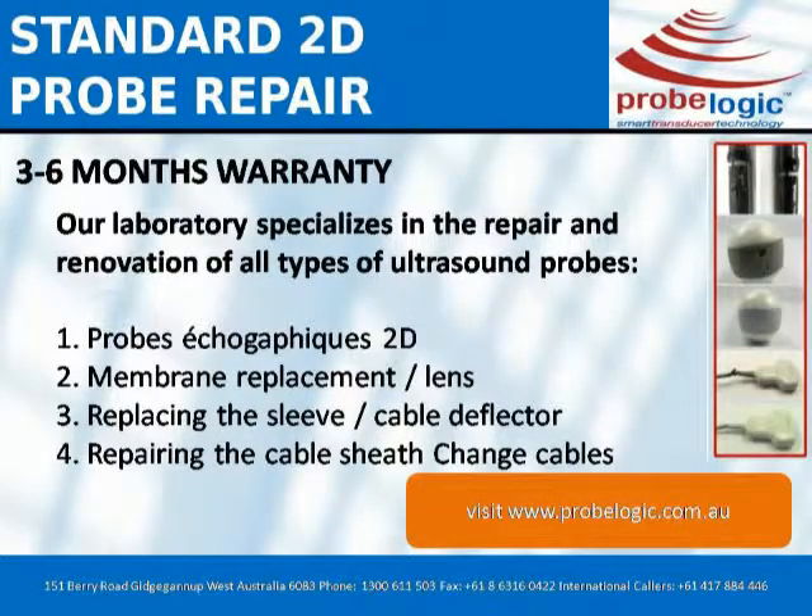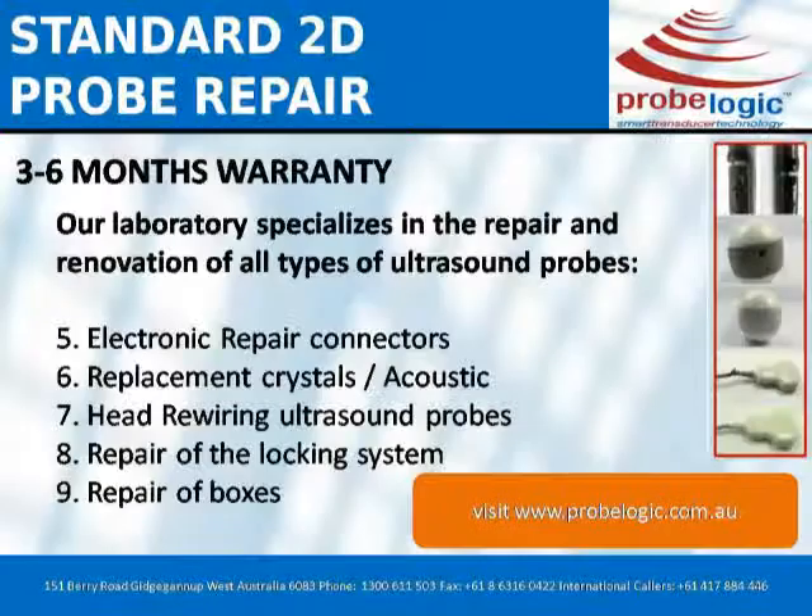Our laboratory specializes in the repair and renovation of all types of ultrasound probes: 1. Probes échographiques 2D. 2. Membrane replacement / lens. 3. Replacing the sleeve / cable deflector. 4. Repairing the cable sheath, change cables. 5. Electronic repair, connectors. 6. Replacement crystals / acoustic. 7. Head rewiring of ultrasound probes.